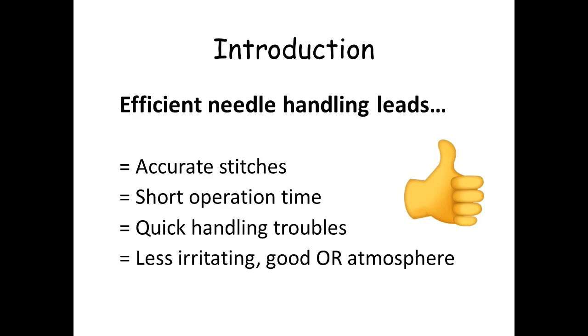Needless to say, needle handling is very important in laparoscopic surgery. Efficient needle handling leads to accurate stitches, short operation time, and quick handling of troubles. In the case of bleeding or injuring the organs accidentally, you can handle the trouble by suturing.